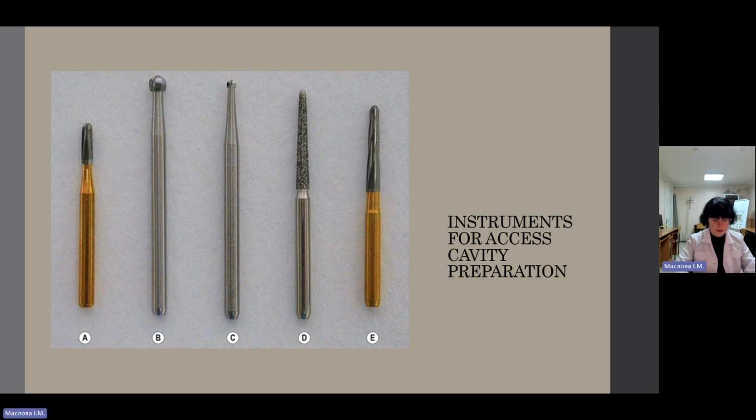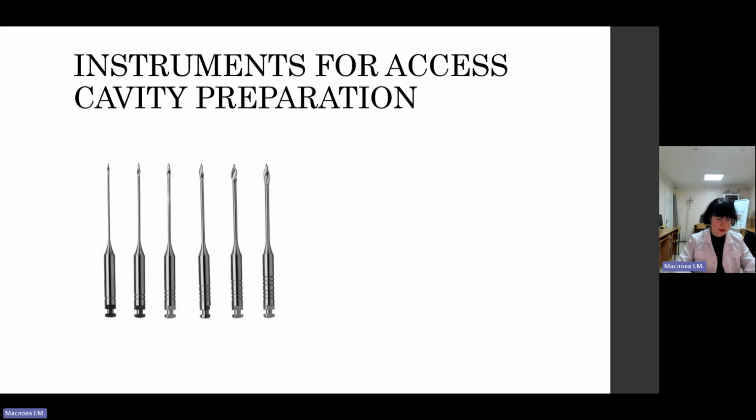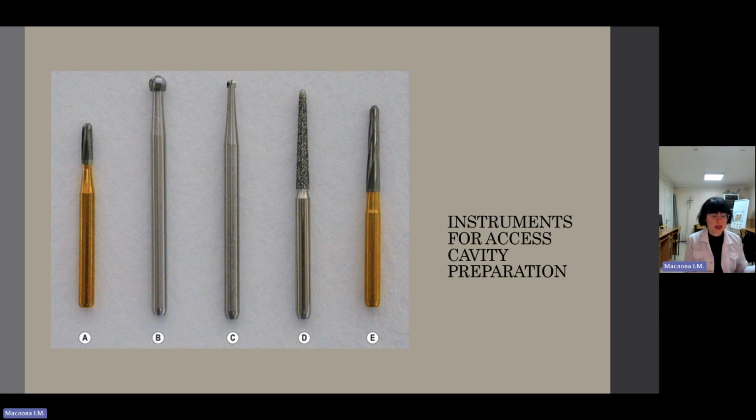Instrument manipulation. Before discussing the instrument manipulation, I want to show you the instruments for access to the orifices, the root canal orifices. The previous slide shows us the burs, the special burs for access to the root canal orifices.